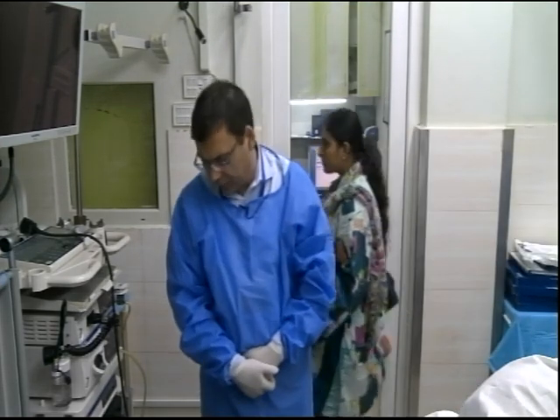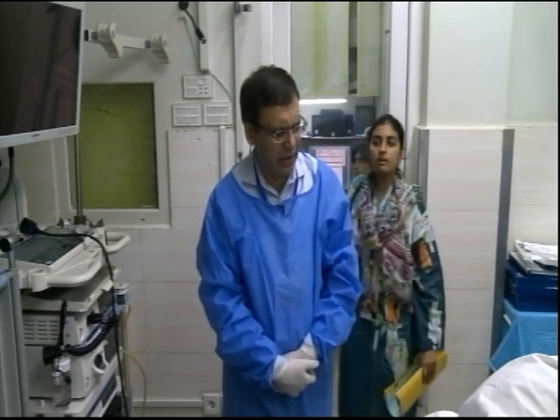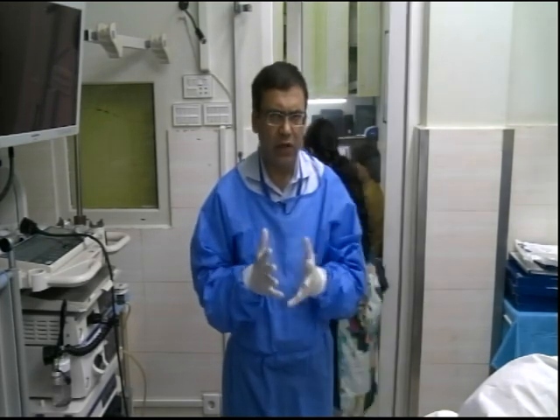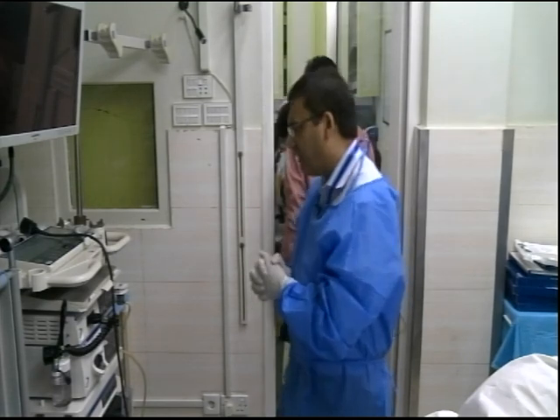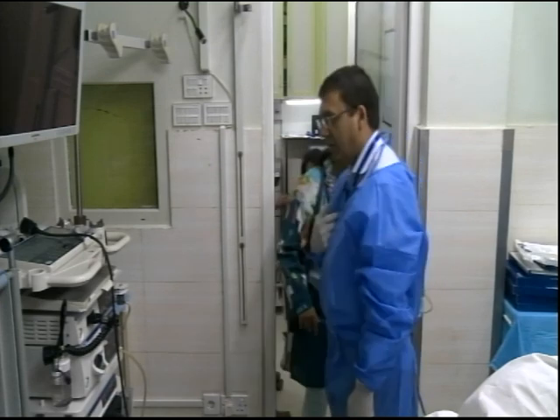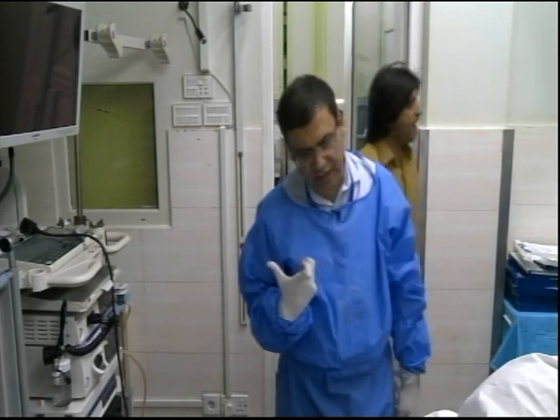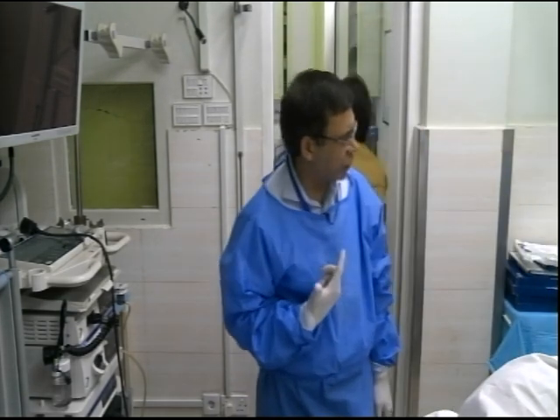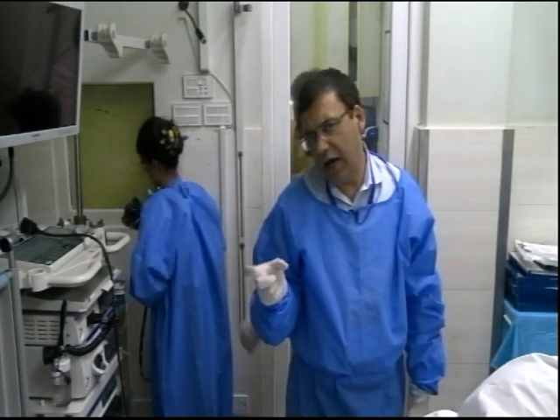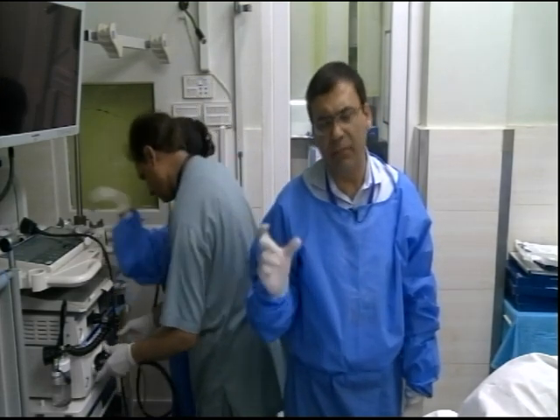Okay, so it's kind of a restaging. So a few points for the rectal EUS. One thing is I usually use radial, but whatever scope is available. Usually I use the radial scope, but I think we are going to do it with the linear scope, which is okay. With regard to staging, especially after chemo or radiation, it's a little more tricky.